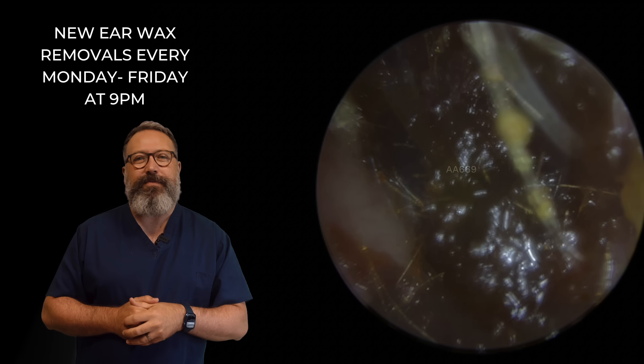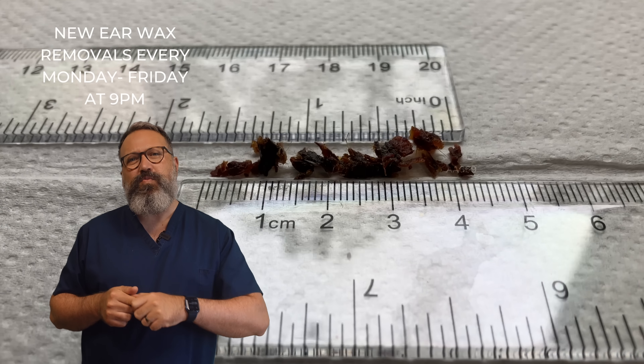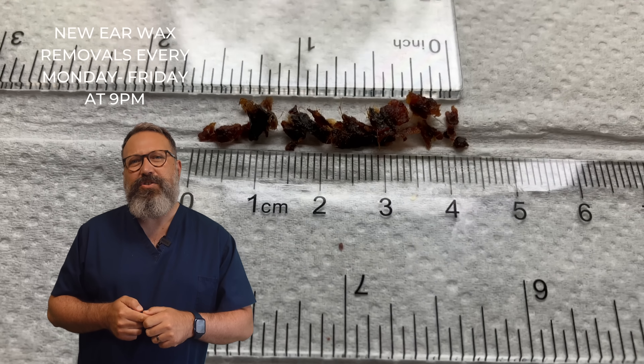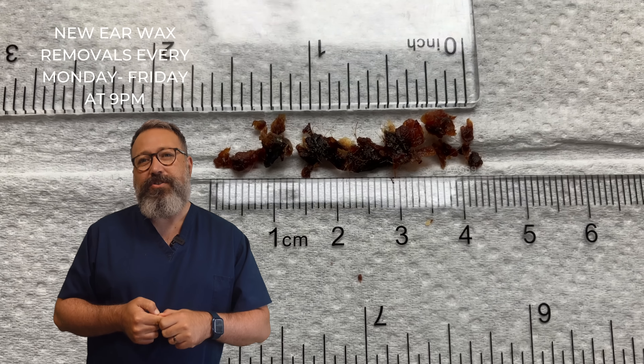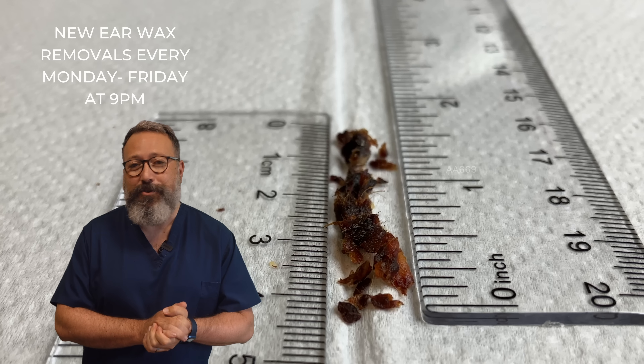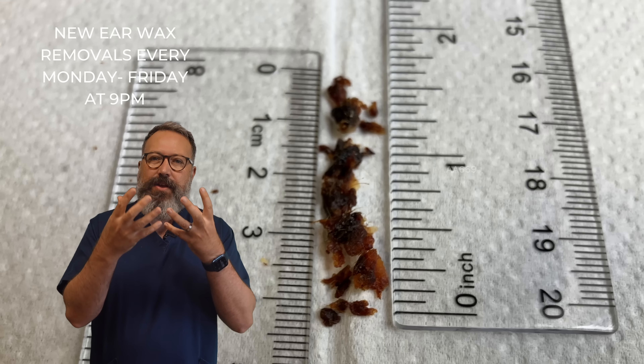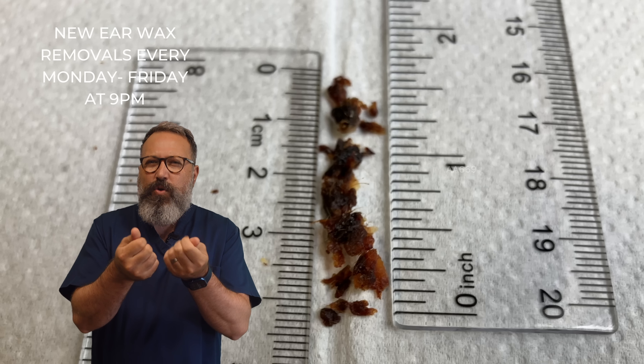Much, much better than when we started. So let's show you what we took out, shall we? So we've got four and a half centimeters — just over one and a half inches there. You could say just under one and three quarter inches — dealer's choice, whatever you fancy. But quite a bit. And very, very dark. And this is hard wax — it's really crumbly and quite angular as well.